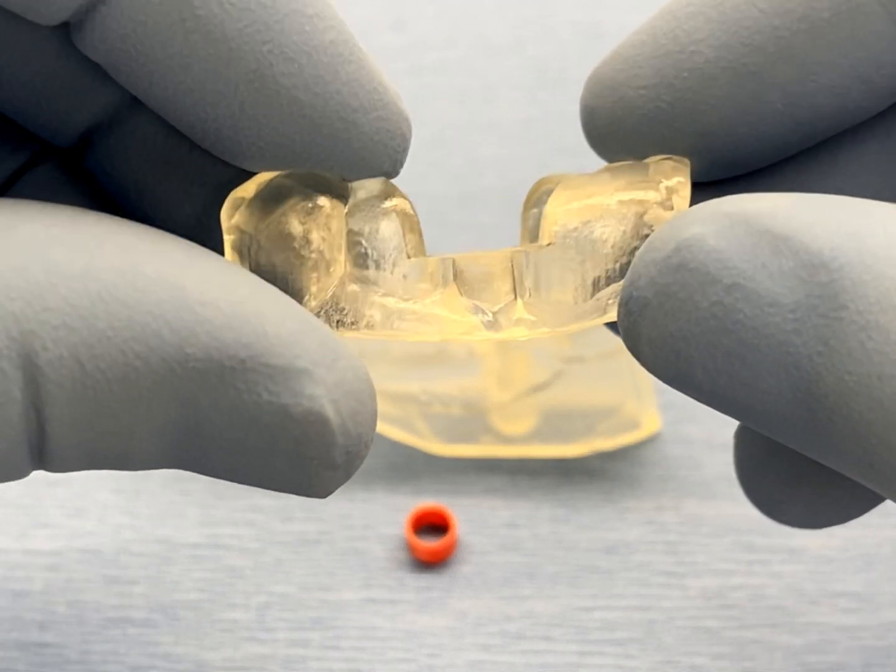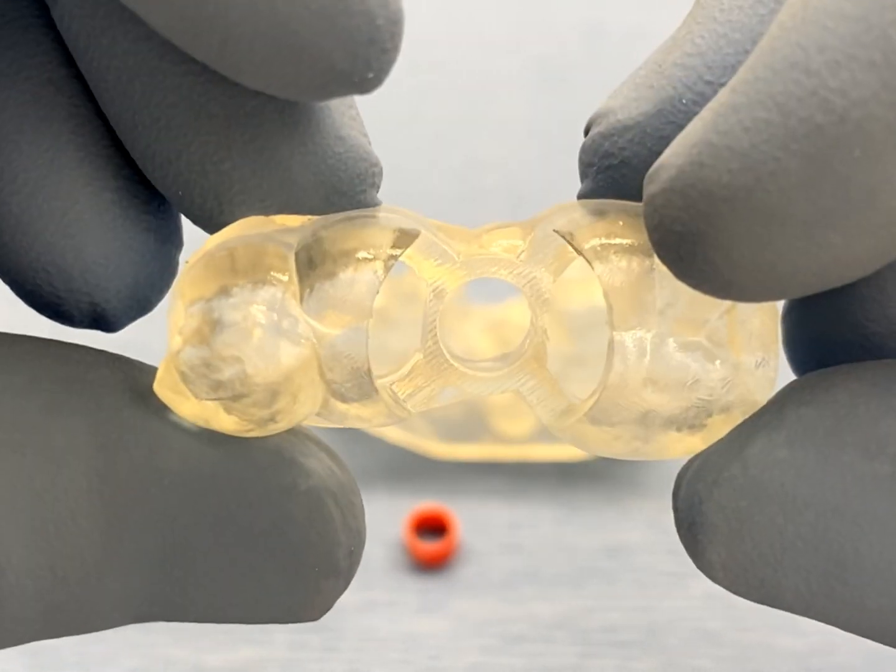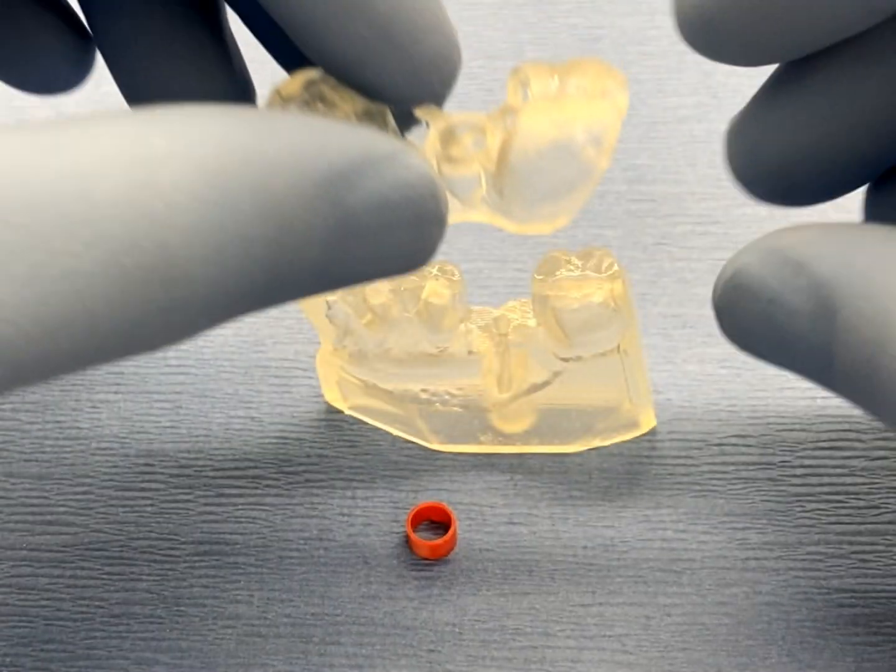Then, remove the guide from the model and verify that the guide tubes are free of any irregularities which could compromise the complete insertion of the GRS surgical ring.